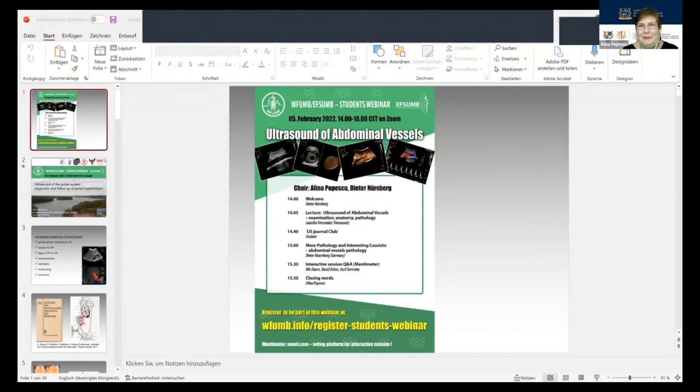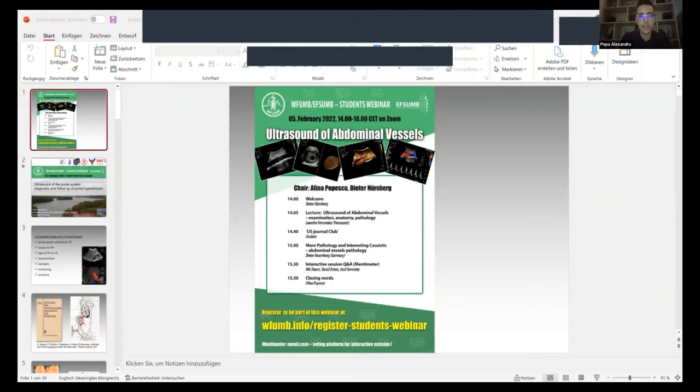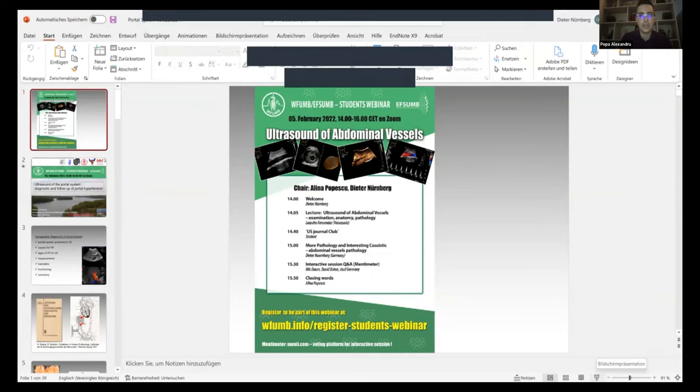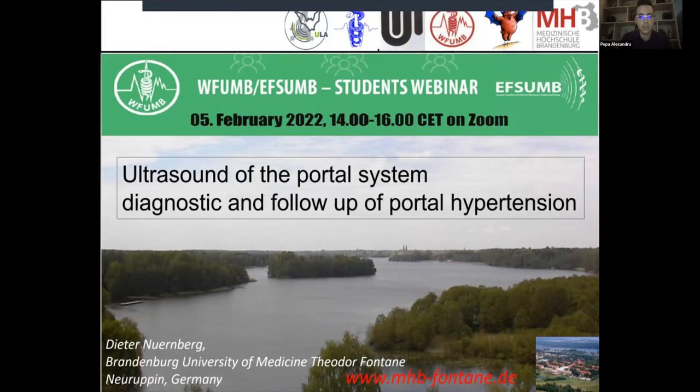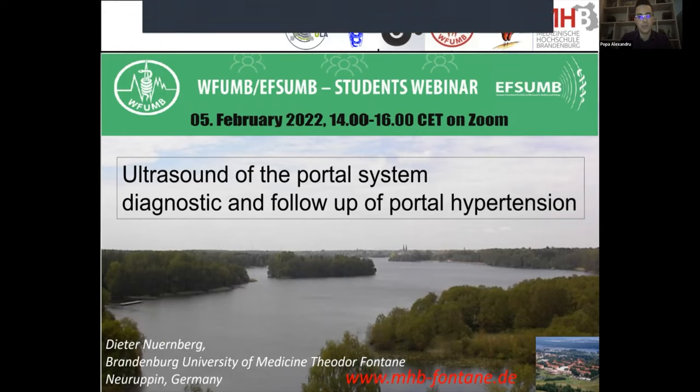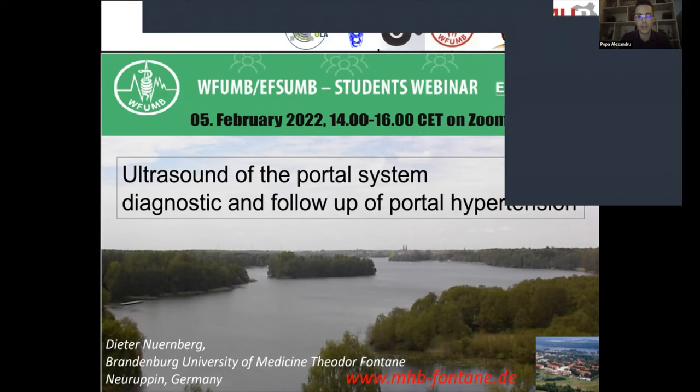Would you answer, Alex, or would you like me to answer? Yes. Actually, it's not invasive at all. We inject a contrast agent, and the contrast agent is made from gas bubbles. So it doesn't interact with the renal clearance or hepatic clearance. It's perfectly safe, we don't have a major contraindication, and we don't know of any important complication of injecting a contrast-enhanced substance. If you want to add something, Professor?